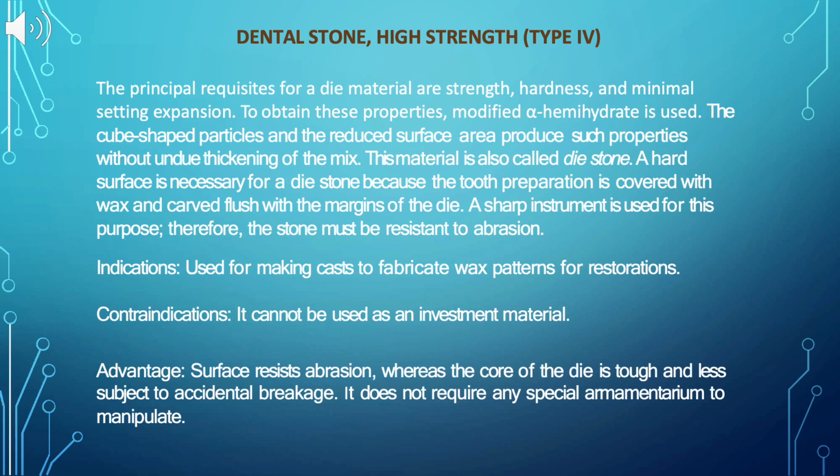This material is also called die stone. A hard surface is necessary for a die stone because the tooth preparation is covered with wax and carved flush with the margins of the die. A sharp instrument is used for this purpose, therefore, the stone must be resistant to abrasion.